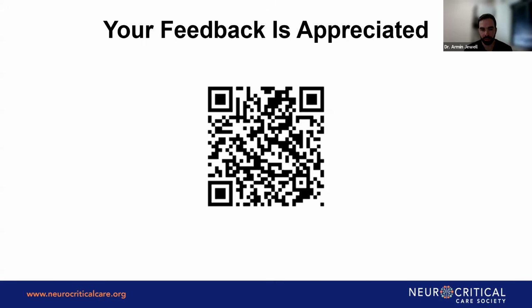Yes, good question. So the Ceribell current approval and the general use that I have seen as the most common use is for acute settings. So acute ruling out of status epilepticus, ER visits, etc. The Zeto technology, as it involves both a full head montage as well as video, is being used in much longer settings, 24 hours plus, and can be used in the ICU, etc., for monitoring.